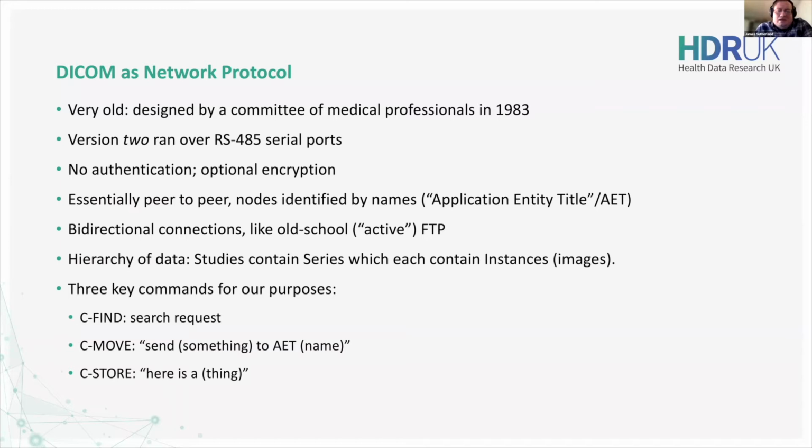So in some ways, the standard we're on now, which happens to be version 3, shows its age. It has no authentication in it. Passwords pretty much hadn't been invented yet, or nobody saw the need for them in hospitals at that stage. Encryption is just an optional extra.